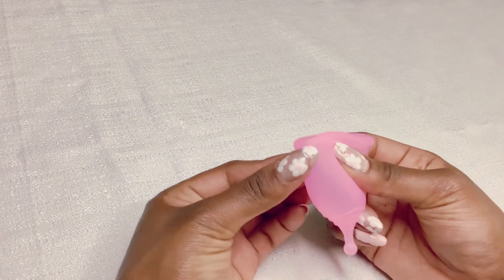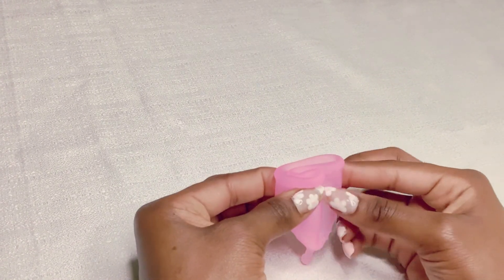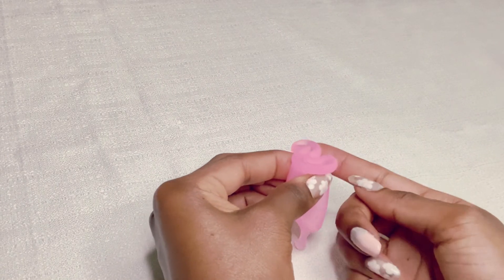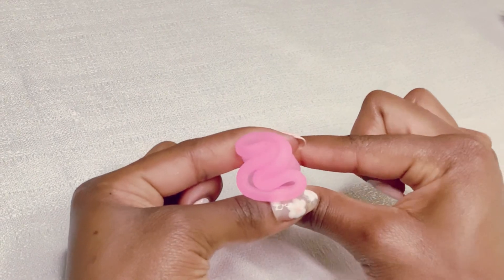So here are the other three folds you could try if the first four didn't work for you. The first of these is the tulip fold. To do the tulip fold, you take one side and fold it to the front middle of the cup, then take the side remaining and fold it to the back middle. This will create a tulip shape or an S shape.